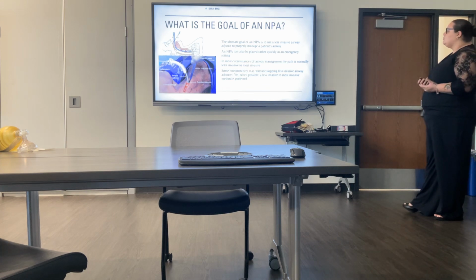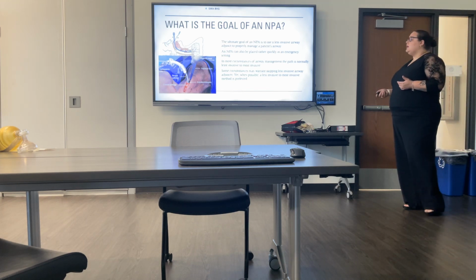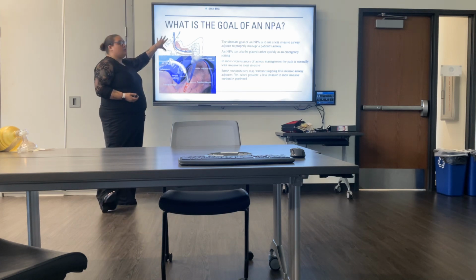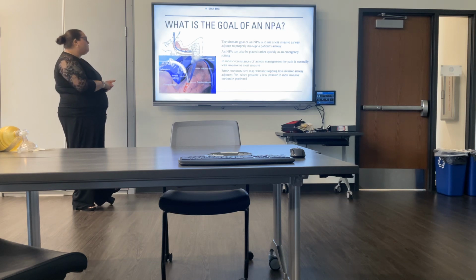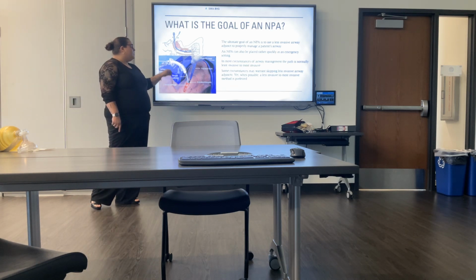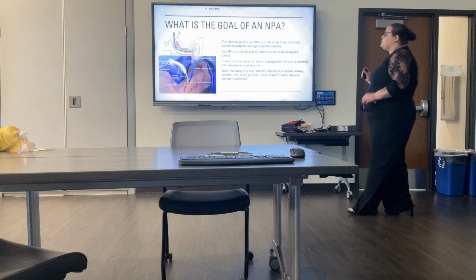It doesn't require as many tools, and in most circumstances you want to go least to most invasive, but some circumstances do facilitate more invasive airway management. So if you can help it, try to go least to most invasive, and NPA is considered more least invasive. When you get into things like endotracheal intubation, you're going into somebody's throat, placing a foreign object in their trachea, which is the ET tube, and you're getting super invasive. You risk breaking teeth, and you risk misplacement of the ET tube. And then you've got your cricothyrotomy, which is when you do a surgical airway on somebody, which is considered in EMS the most invasive form of airway management, which we want to avoid at all costs if possible.